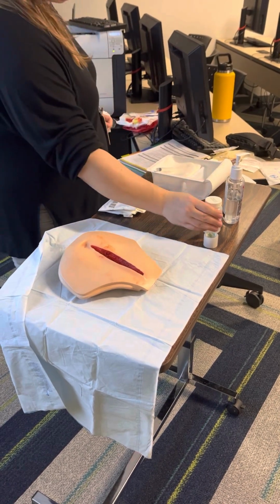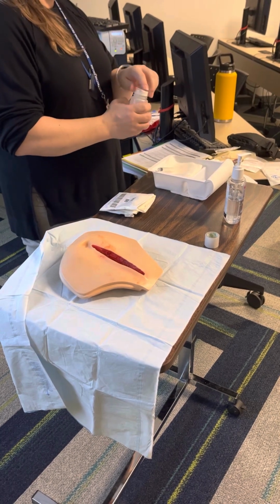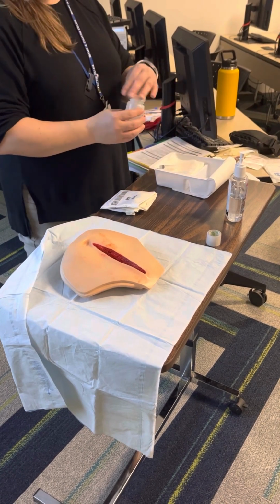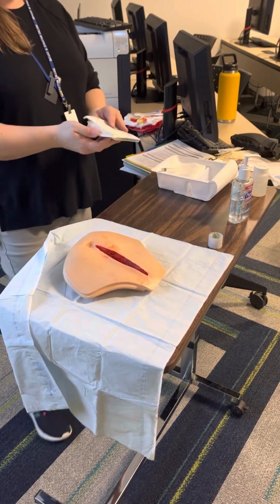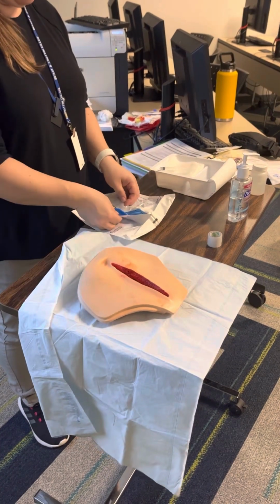I'm then gonna take my fluids. I'm gonna also make sure that they're not expired. I'm gonna take them at an acceptable height of 1 to 2 inches. I'm gonna pour some in the open area in the container. Place the lid back on. I'm not gonna cross over my sterile field. I'm gonna take my sterile gloves and open them up and put them on.